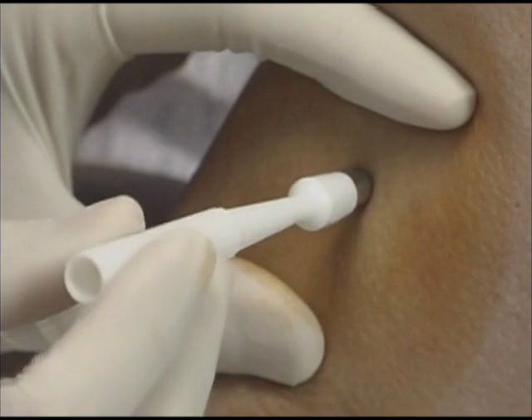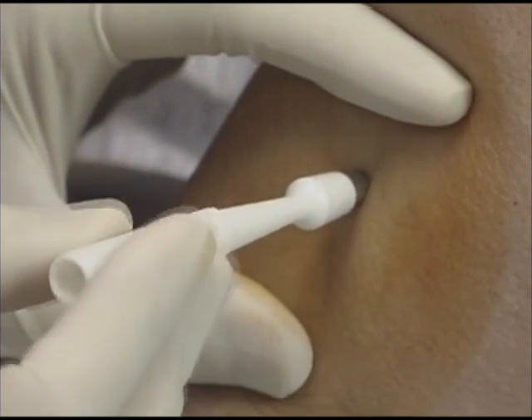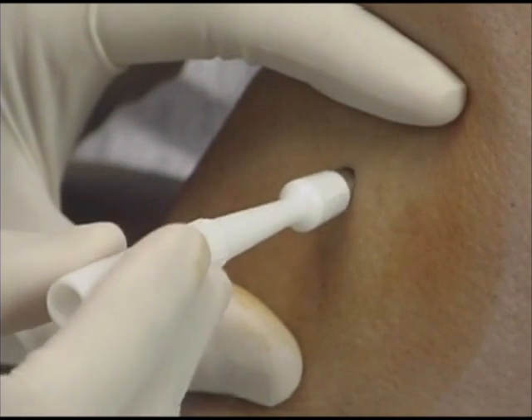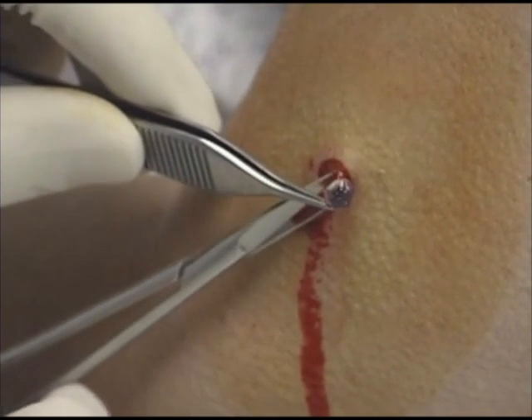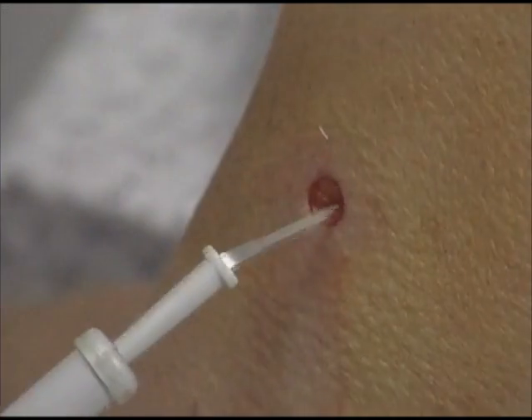This 6mm punch is rotated back and forth between the fingers while pressure is being placed against the skin. The punch biopsy specimen is removed by snipping off the core at the base with iris scissors. Good hemostasis can prevent hematomas, infections, and dehiscence. The lack of bleeding makes it easier to visualize the skin edges while closing the defect.